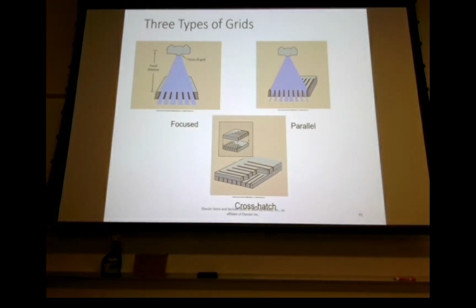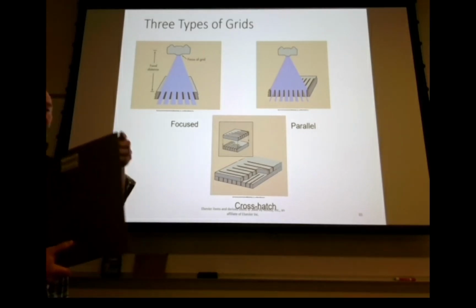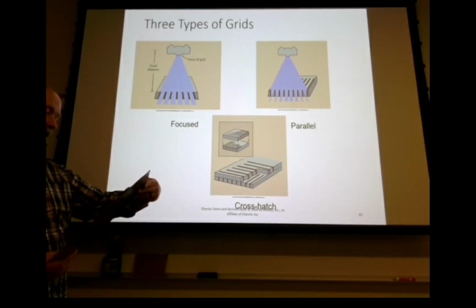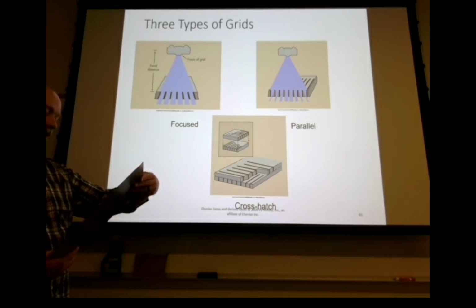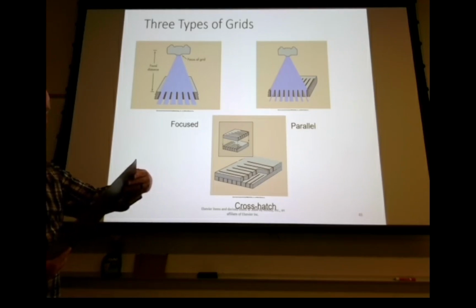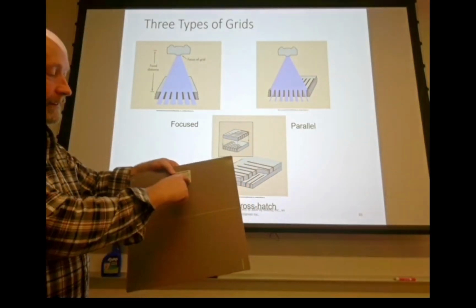And then I'm going to pass around another one, and I'm not going to pass the box around, but you need to look at the label on it, because it's got some very peculiar definitions on it, and this one's bent, it's messed up. So this is an 8-to-1 ratio grid, 103 lines per inch. Recommended focal range is 34 to 44 inches. And it also says tube side on it.